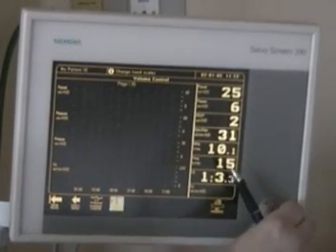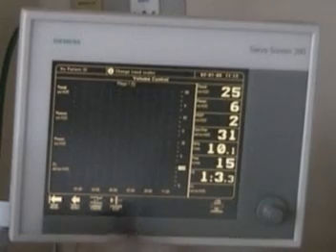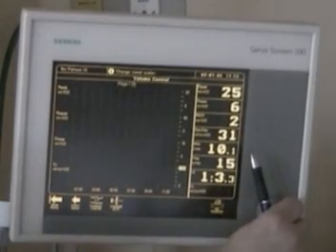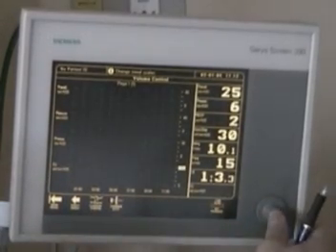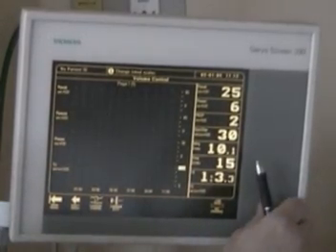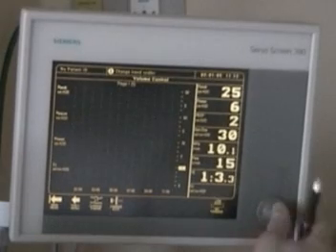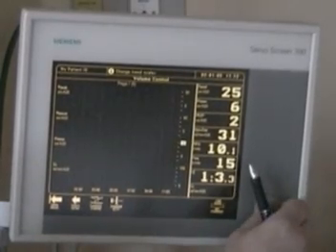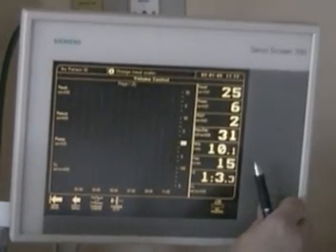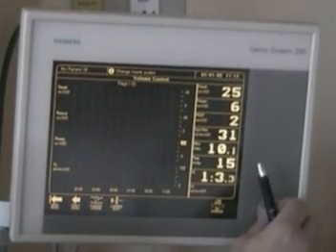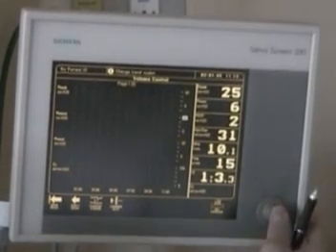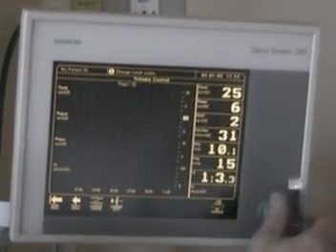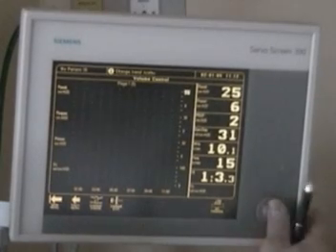That won't allow us to do anything on the time, but we can change the scale so things are a little bit easier to see. Let's go to 30 for peak, and we'll change the pause pressure and the peak pressure.